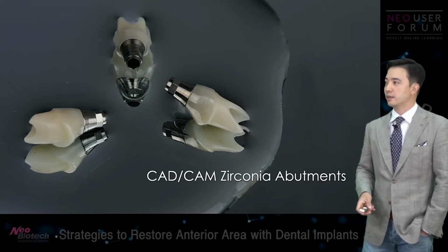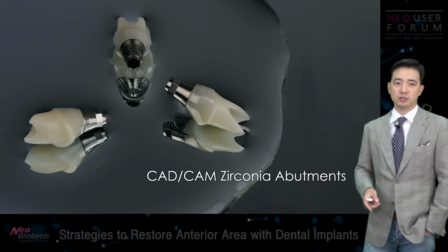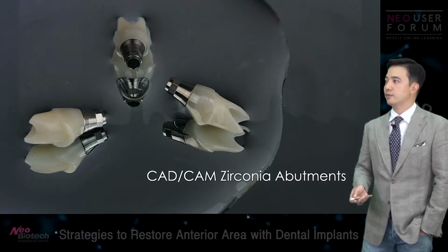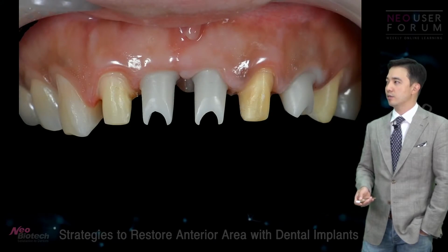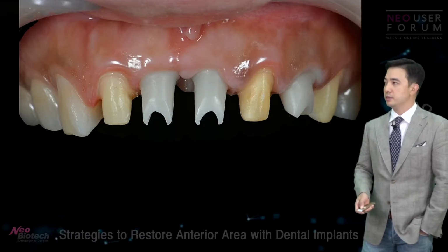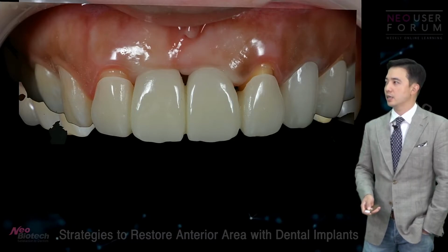So, and I think your patient's soft tissue likes that smooth surface, okay? So after putting in the zirconia abutments, I just tried to put PMMA provisional restorations on top of it, okay?